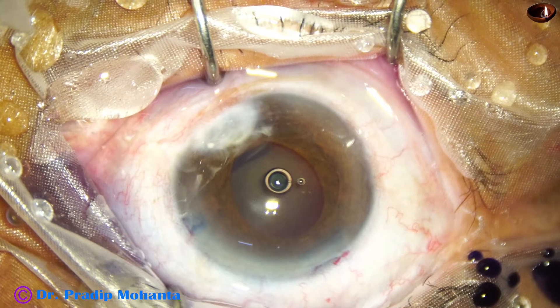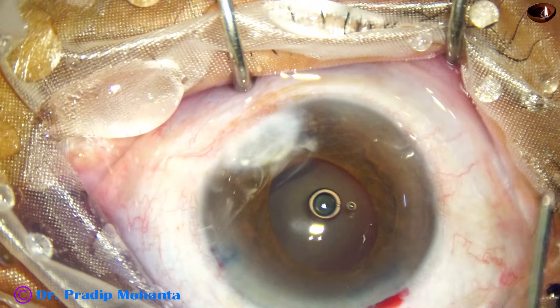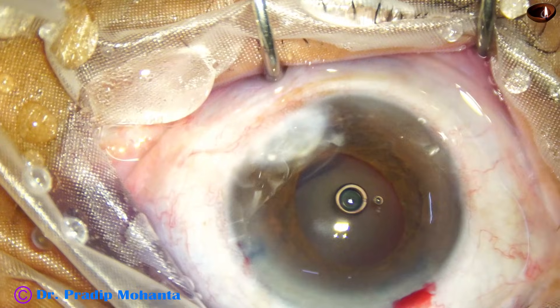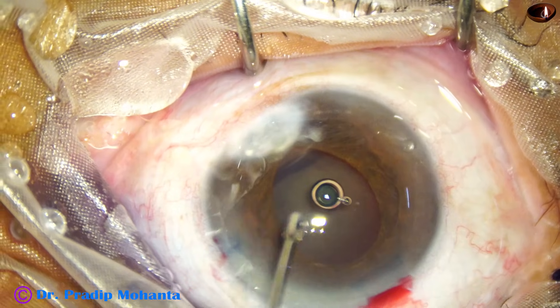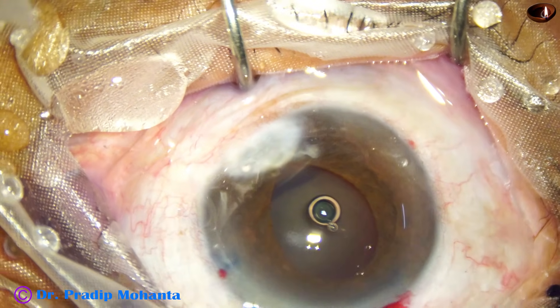So my plan is to cut the adherent leukoma, and for that I fill up the anterior chamber — and this is again some pupil dilating agents.